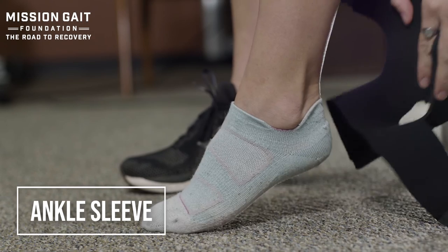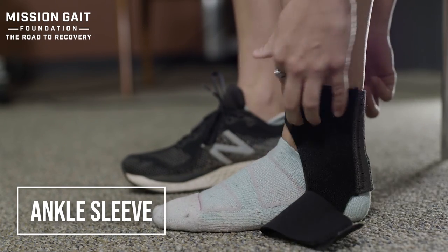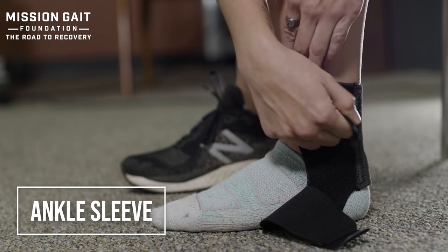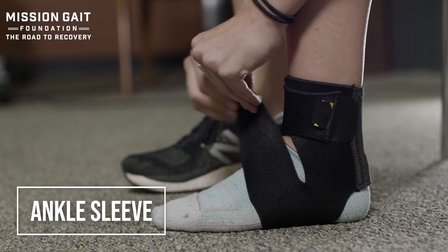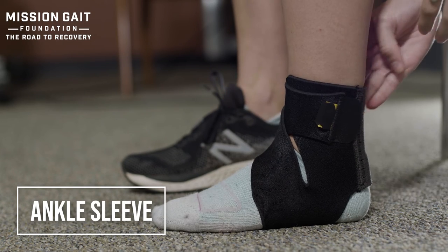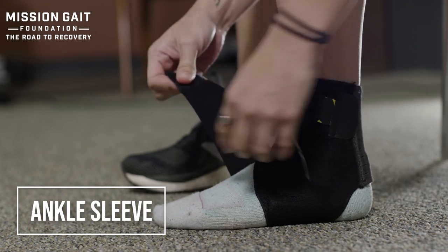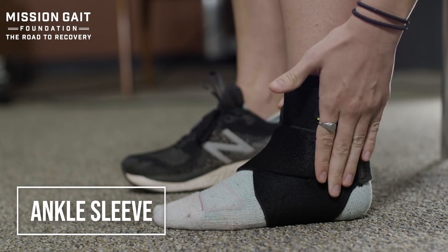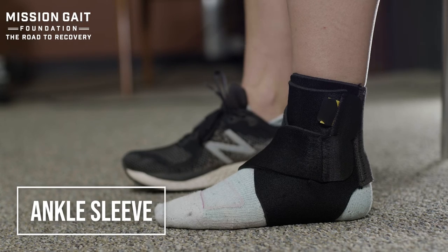The ankle sleeve can either be slip-on or like this one, a Velcro closure. It's elastic material that wraps around and can Velcro or slip into position to create compression, warmth, and some proprioceptive reminder. Taking the time to get everything comfortable, pulling it all the way around and covering all the skin creates good compression to help support that ankle. From a sleeve standpoint, this won't prevent ankle sprains — it just gives compression.